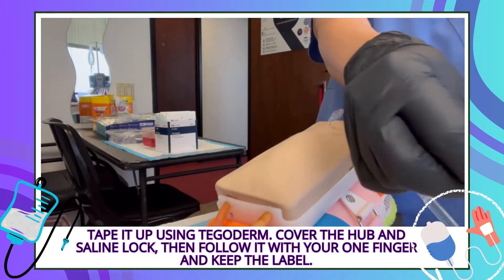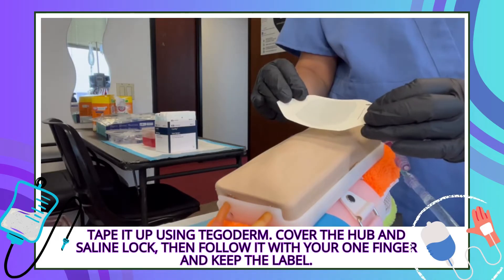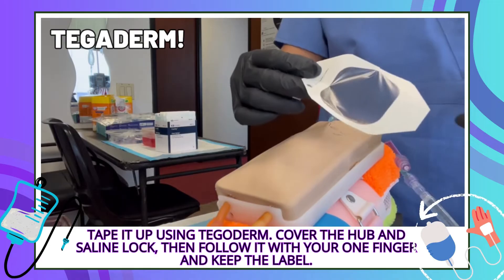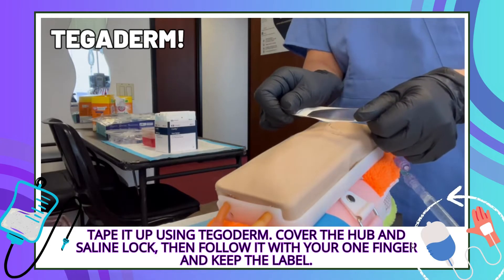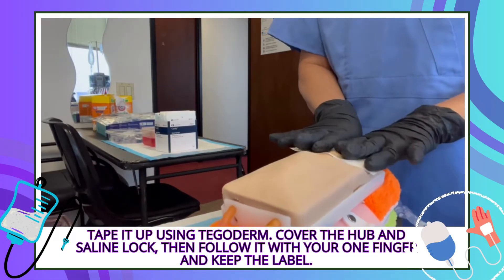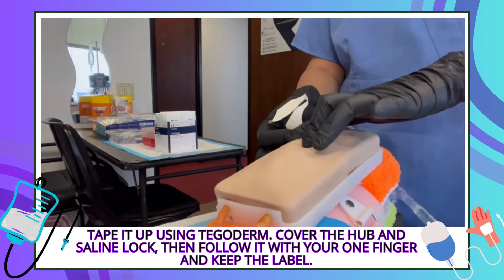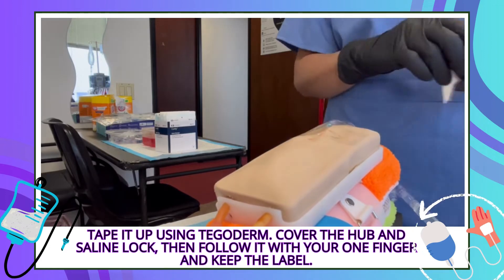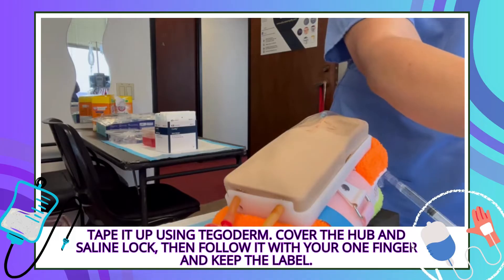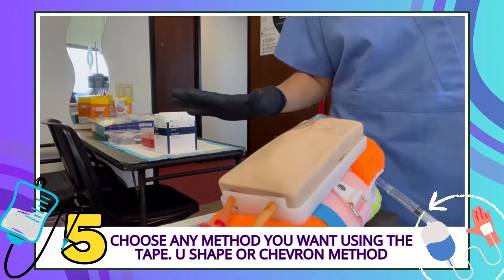You can have the Tegaderm open already in your sterile field so you can just grab it. When you grab it, make sure it covers and provides a window — it's just like a second skin. We do not throw away the backing because it's the label. If it's crumpled, stretch it out, cover a portion of the hub and the saline lock, and smooth it with your finger so it's not crumpled. There it is — a lovely window. If there are any complications, we can see them.